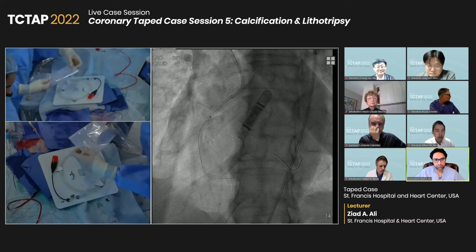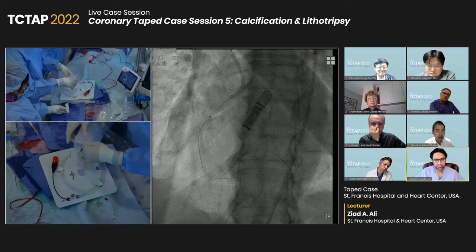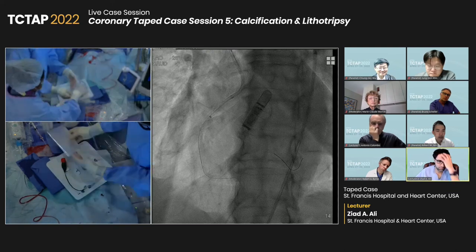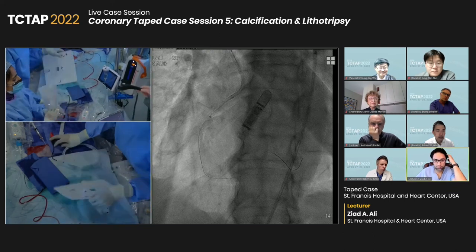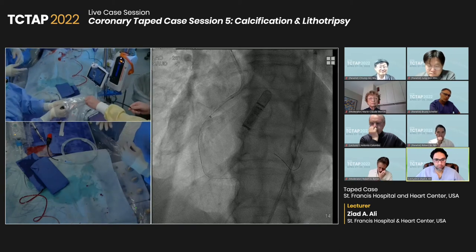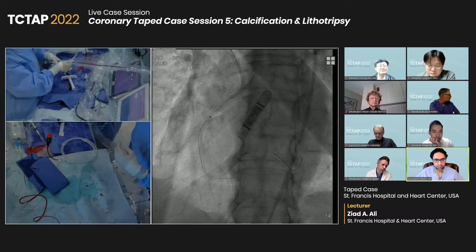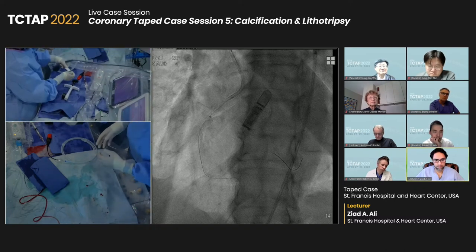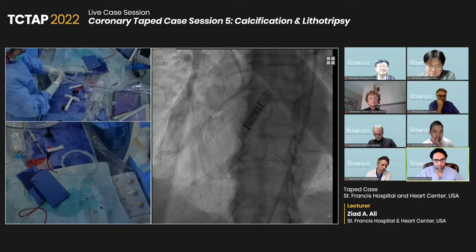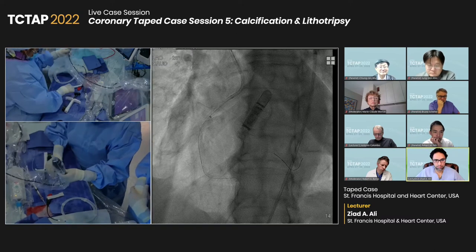This is arguably the most difficult part. What we're going to do is take our balloon out. You can see the front part, sort of the condom part of this, at the very proximal edge with an arrow on it, is the part that we're going to put the rubber bands on first because it's slightly too big for the hole. If you don't do this early enough, you can potentially unsterilize it.